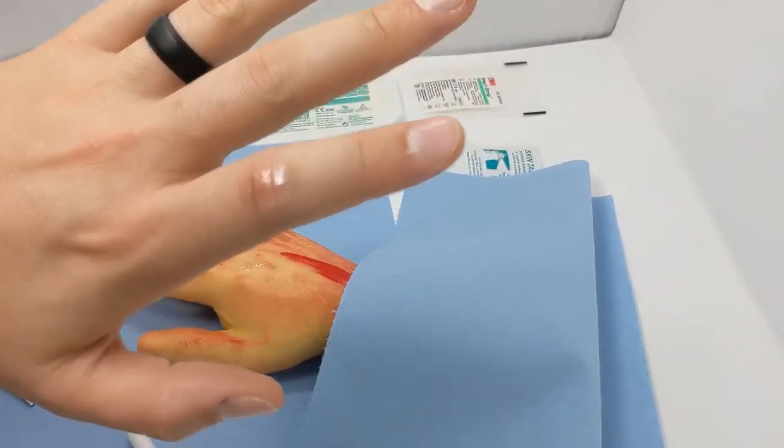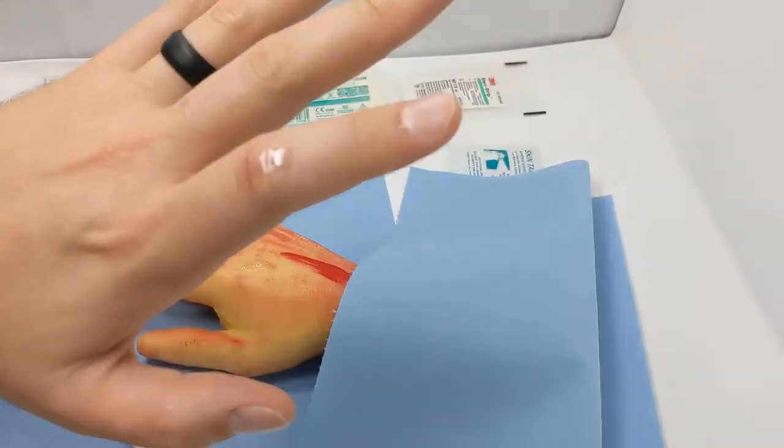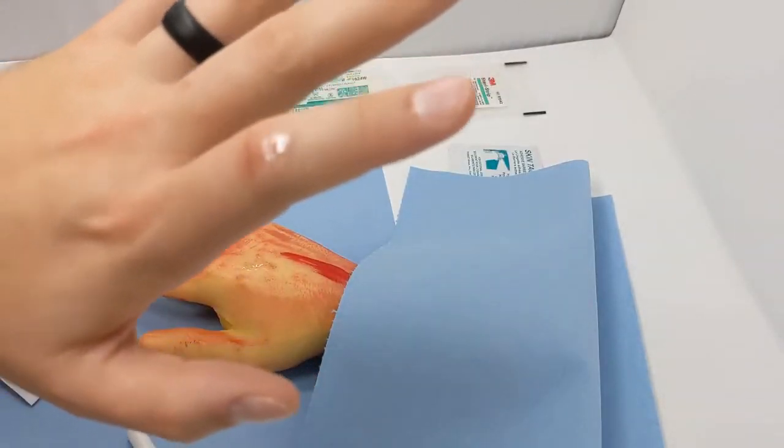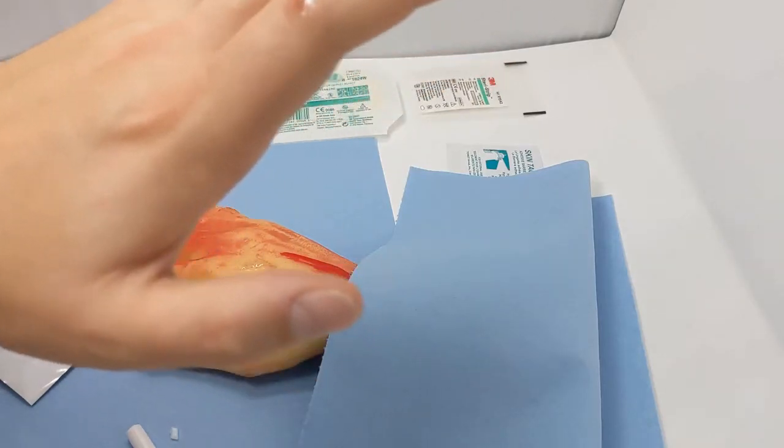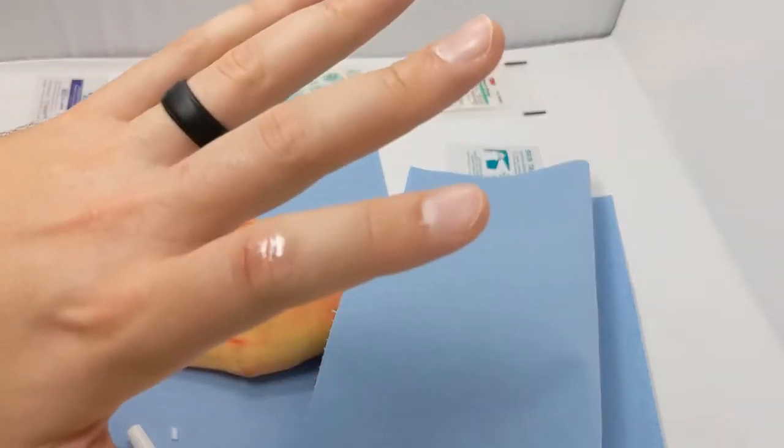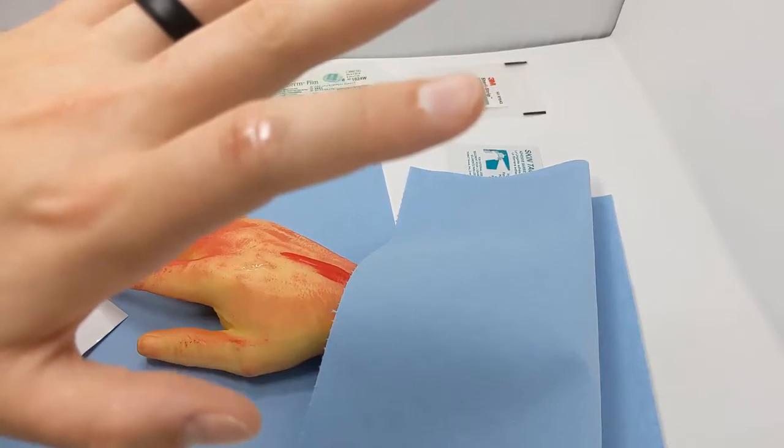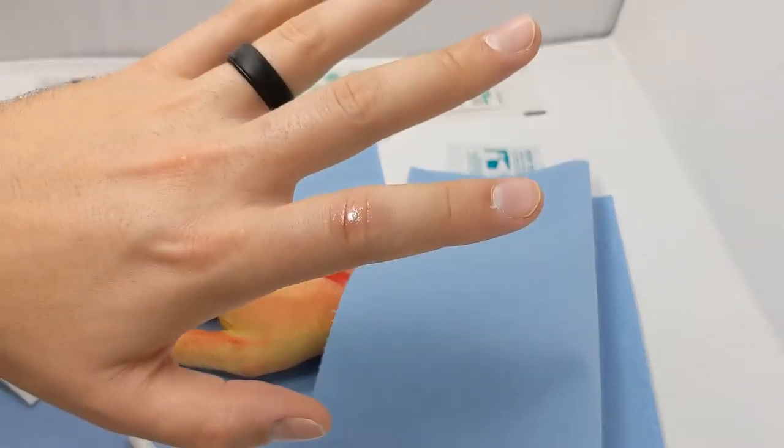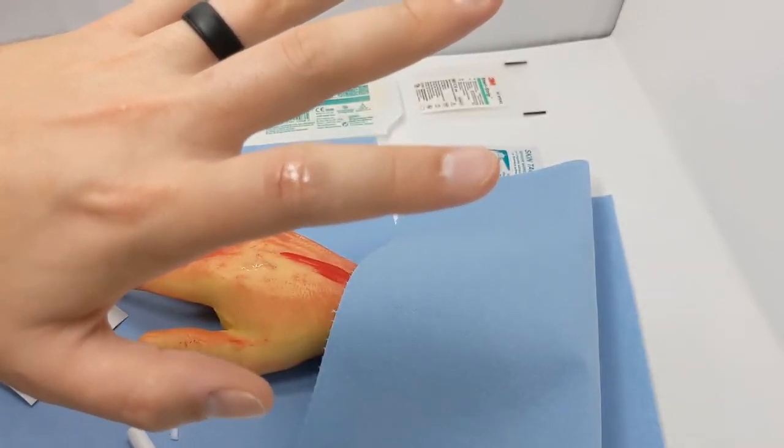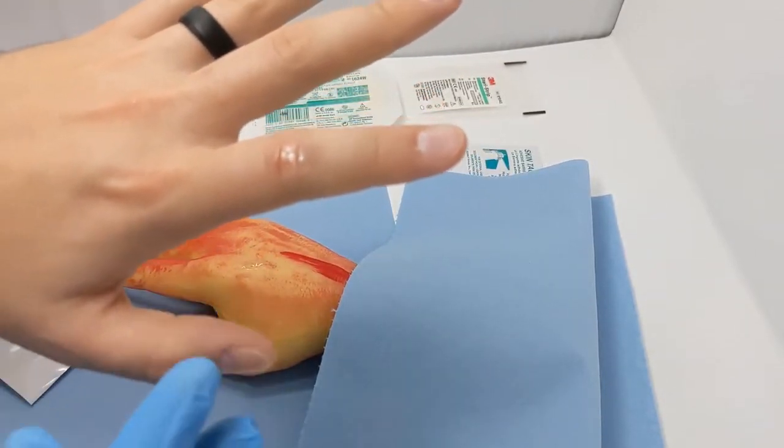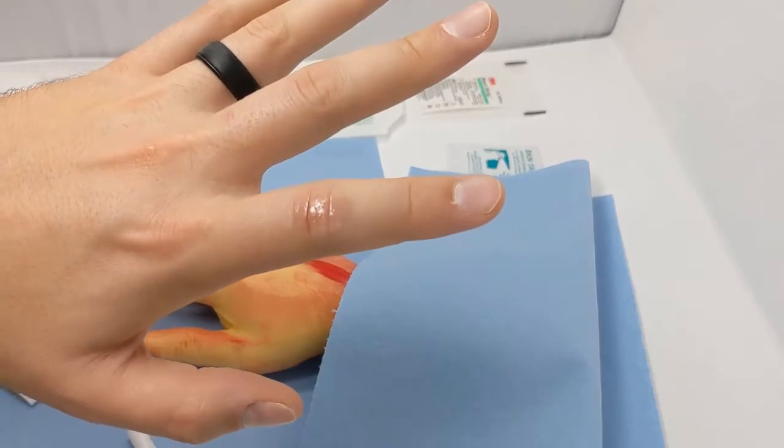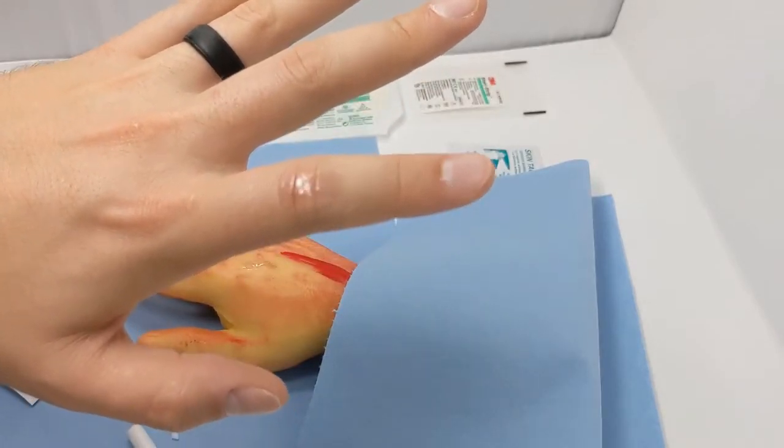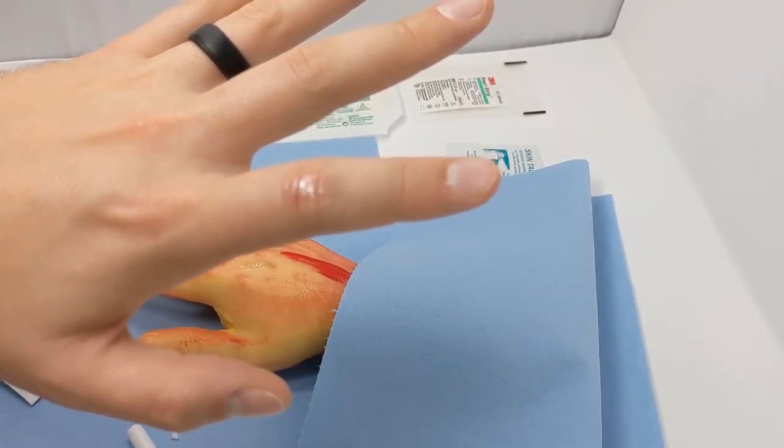This way is really good for areas that are small, not super deep, areas of joints like the face or the fingers. What it does is create almost like a second layer of skin on top to keep it clean and from getting infected, and it will keep that wound closed. This generally lasts around five days or so, and then it will just naturally fall off.